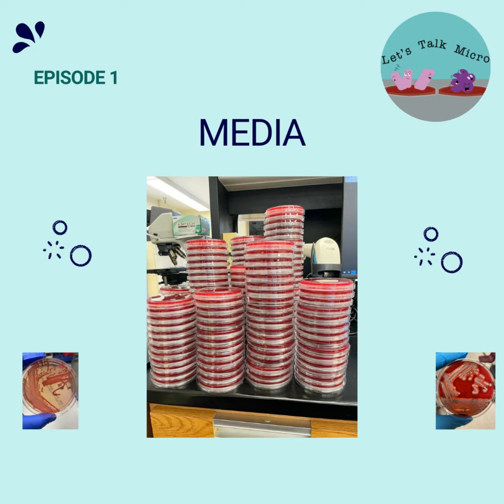That's how we catch infections. Organisms like our body temperature. So these incubators are set to 35 to 37 degrees Celsius to mimic that temperature. In addition to the temperature, we need the correct pH. And the books show that most clinical bacteria like a range of 6.5 to 7.5. The media has buffers to make sure to maintain this pH.